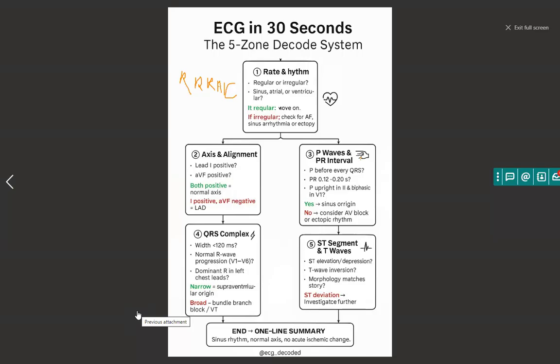So a lot of people use the paper method, and I've done videos on that as well, where you just mark the paper and then you shift the paper on your ECG strip just to see if it maintains the same distance between R to R across your reading strip, and then that can give you an idea of the regularity.